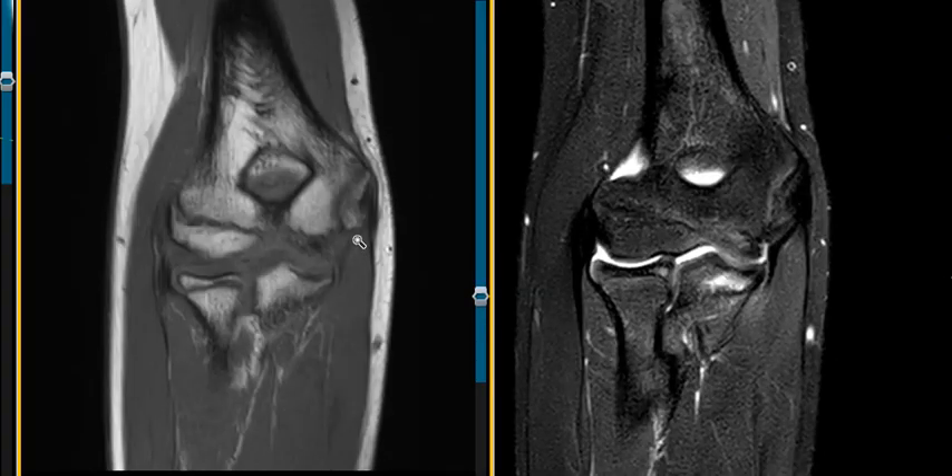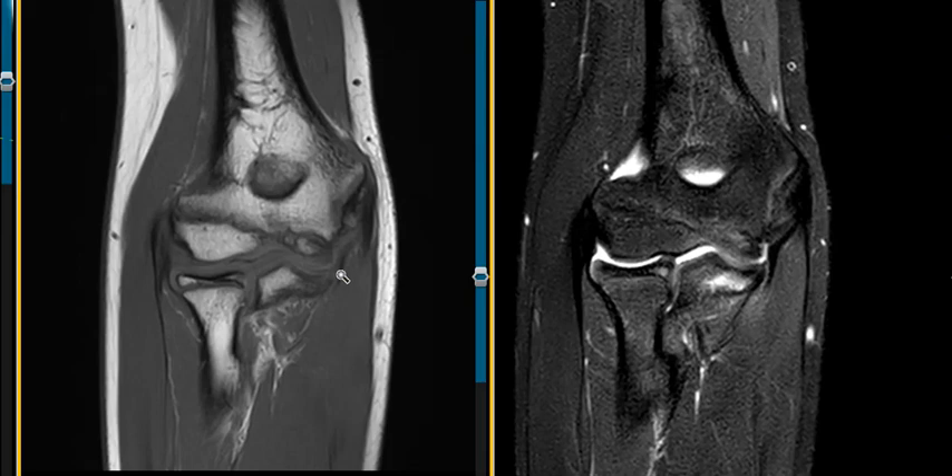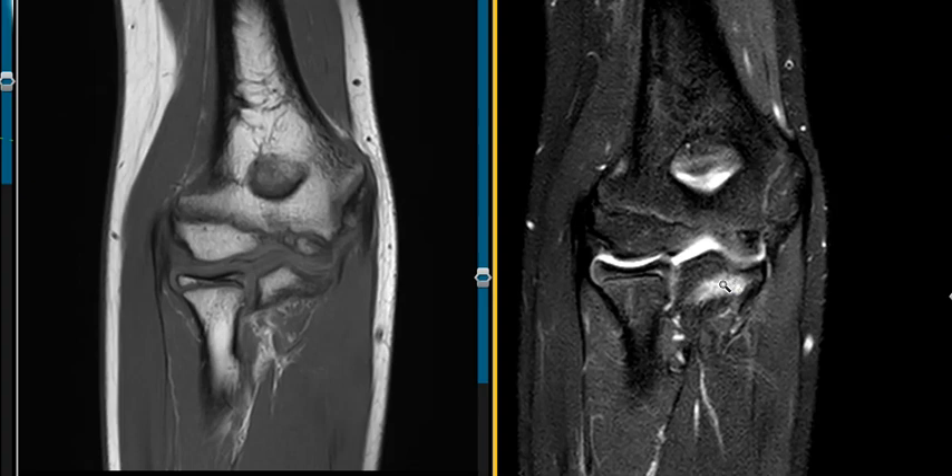This is a T1-weighted image — the finding really doesn't show up very well on T1. You can see the UCL coming down, and it should attach over here, but there's a little separation. It stands out much better on the proton density fat-suppressed sequence. So the final diagnosis is: UCL partial tear, stripped from the sublime tubercle, with stress reaction of the ulna, and no displaced fracture. Thank you so much.